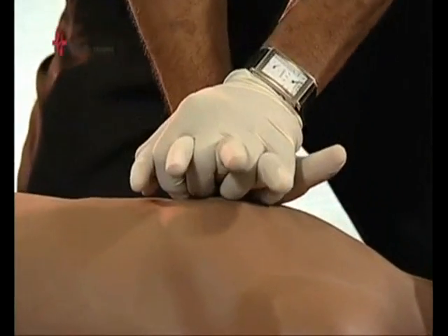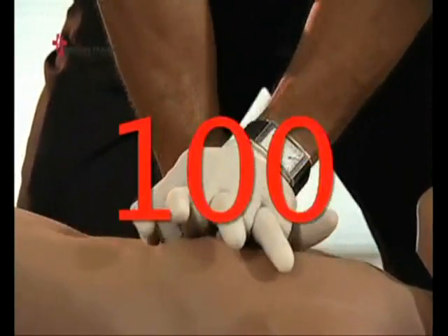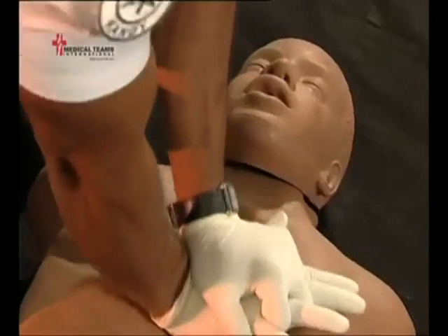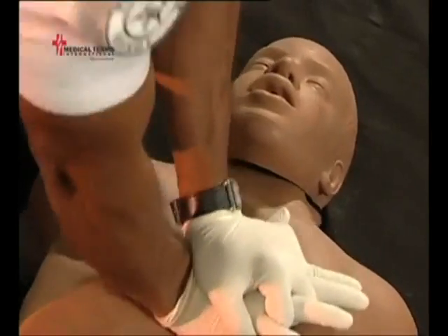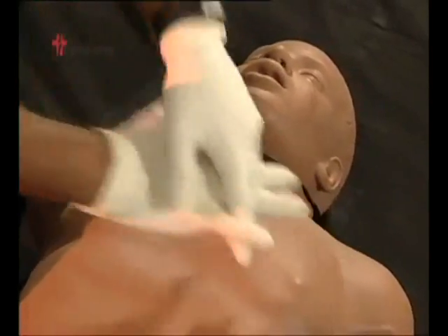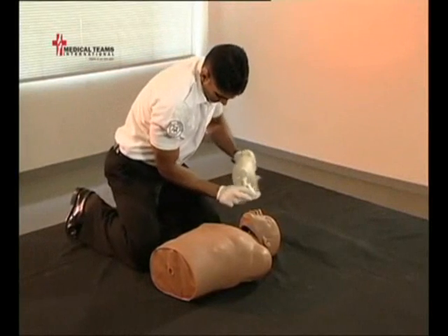Pay attention to the smooth, consistent chest compressions at a rate of 100 per minute. After 30 compressions, provide 2 breaths and stop to observe the chest as it rises and falls. Resume chest compressions. After 2 minutes, check for a carotid pulse.